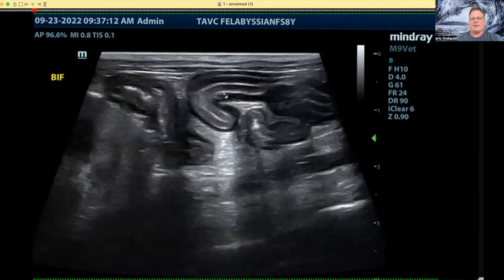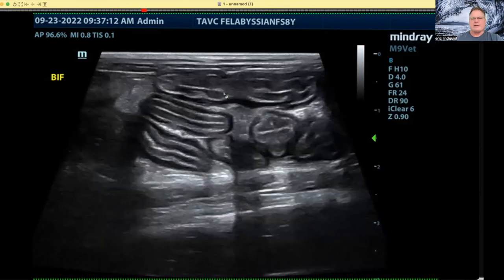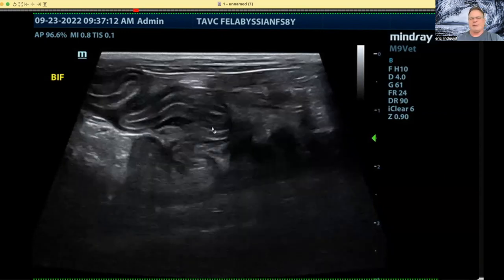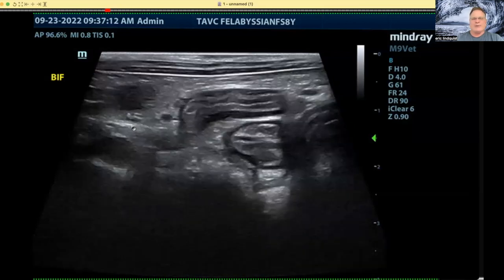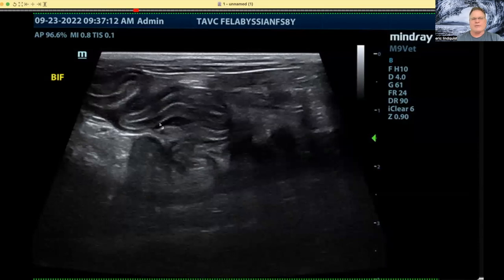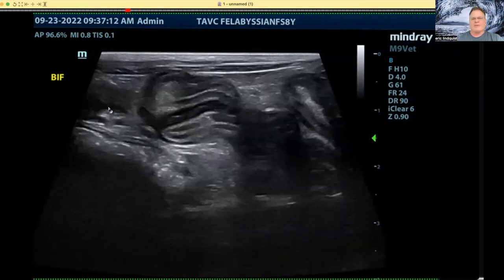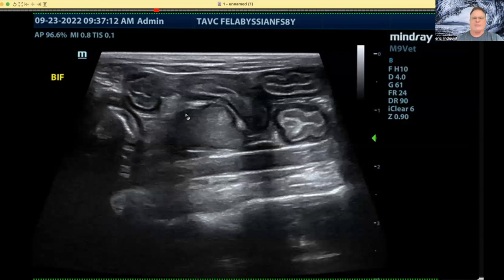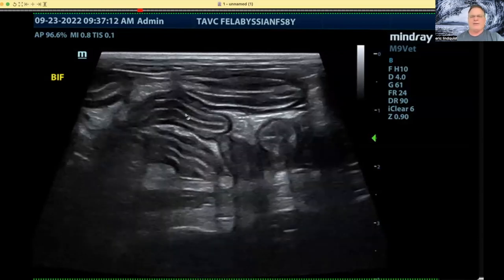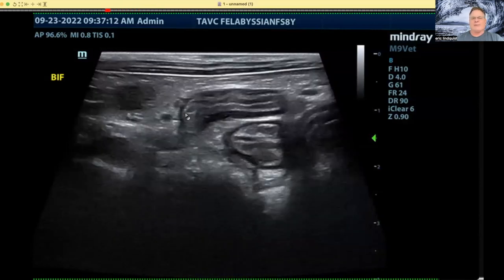We have idiopathic muscularis hypertrophy, and this is typical of inflammatory bowel disease. It's not obviously histopathological — in a perfect world we'd get full-thickness biopsies. Maybe we do intraoperative ultrasound and get full thickness from the more prominent areas like this muscularis, which is more prominent here as opposed to here, but the submucosal layer is still intact all the way through. Maybe this is a precancerous state — we don't really know until we get histopath.